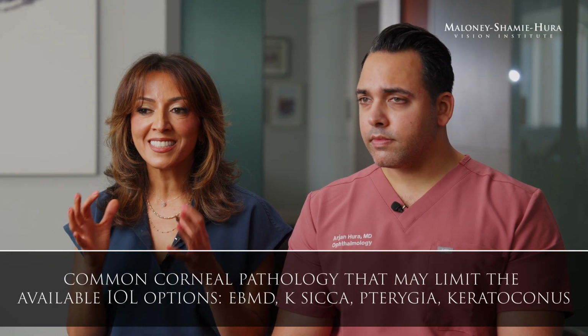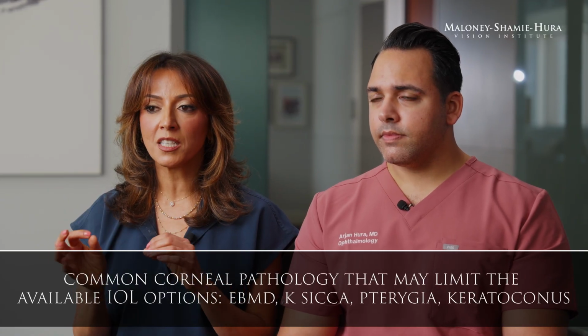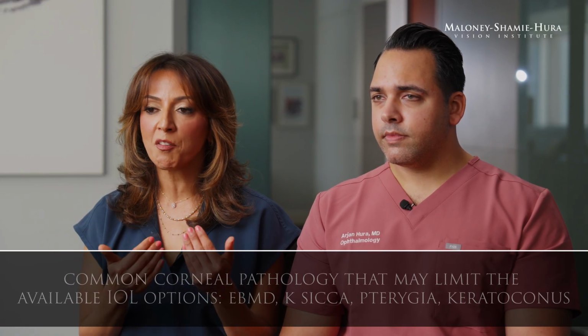Really, there's nuances about those decisions, but a patient with EBMD, we will do a corneal polish ahead of time, but again, that corneal surface is not pristine, and we'll have to think about the impact it'll have on the quality of their outcomes if they were to have a multifocal lens, as an example. Now, the Vivity or the non-diffractive extended range lens would be a reasonable option for a patient with corneal findings as long as their central 3 millimeters of the topography is essentially normal.